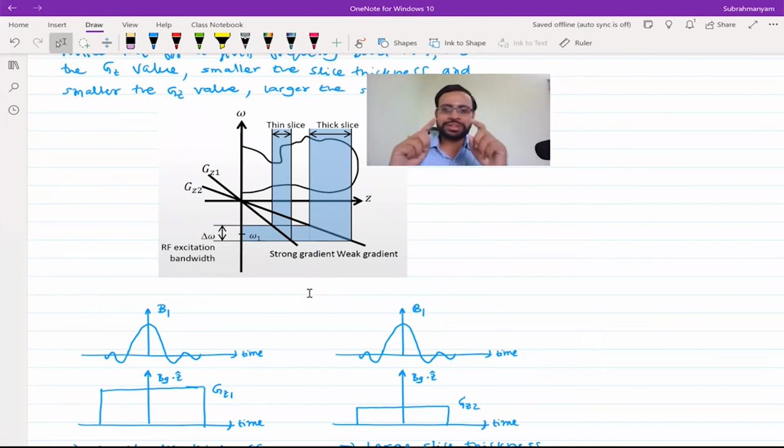Since each of them is rotating at different speeds, and the result you are looking at is the projection of the magnetizations of all those tiny magnets on the XY plane, within that single line all would be in coherence. But if you take multiple lines, since they are rotating at different speeds, your magnetic field on the XY plane would become zero. So that's another problem.